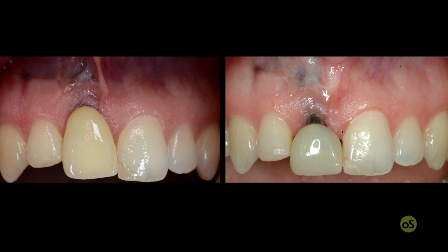And what is really incredible is how this soft tissue has the capability to really fill the space that was previously occupied by the implant-supported crown. So now, instead of working with a triangular, narrow-tip, epithelialized papilla, you have to work with very, very wide supracrestal soft tissue that can be used at the time of the surgery as a trapezoidal anatomic papilla to be desepithelialized in occlusal and palatal direction.